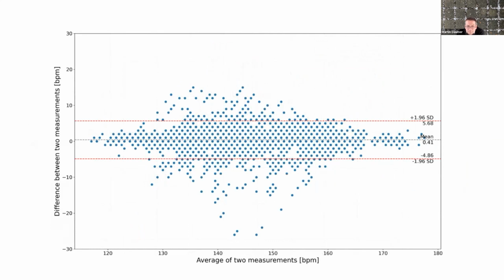For error analysis, different methods are used. Here, a Bland-Altman diagram is shown, which is typically used in medical statistics. The average measured heart rate of the home CTG device and the benchmark CTG device is plotted against the error between the measured heartbeats. It is seen that not all the data points lie inside the 95% confidence interval. With this, we concluded that the tested home CTG devices are prone to error, which should not be neglected.